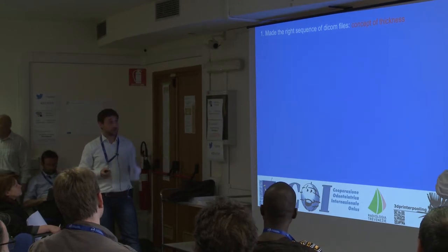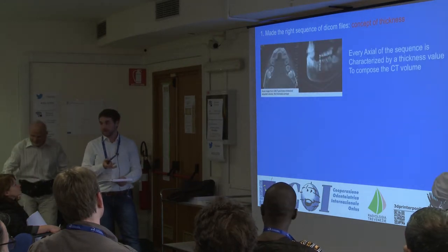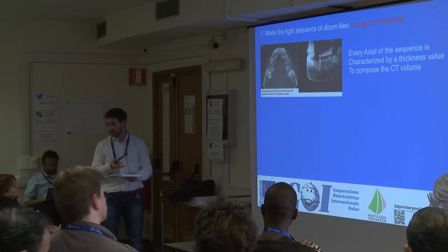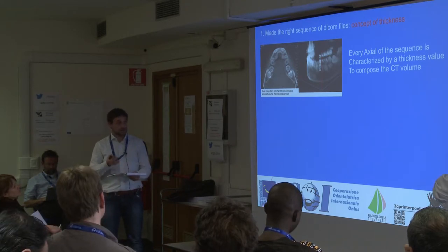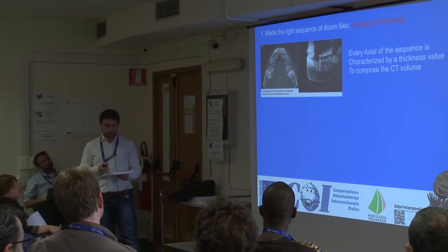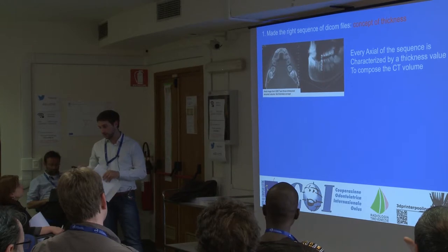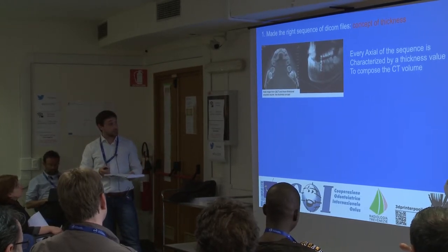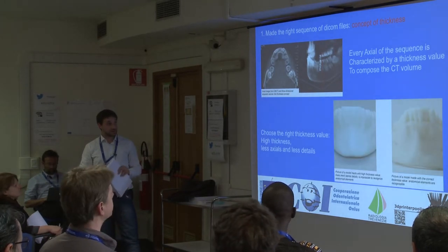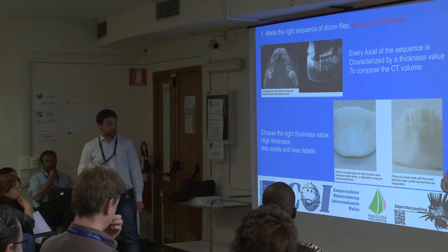The first step is the concept of thickness, because the volume of the data is composed of a lot of axial images, a lot of DICOM images in medicine, characterized by a thickness. A thickness is a value that you can choose when you export from the CT software to a DICOM package. And it is important because when you choose the thickness, you characterize your 3D model.